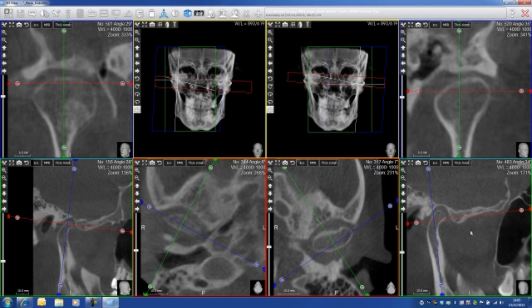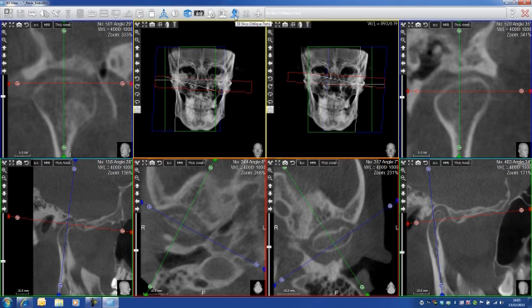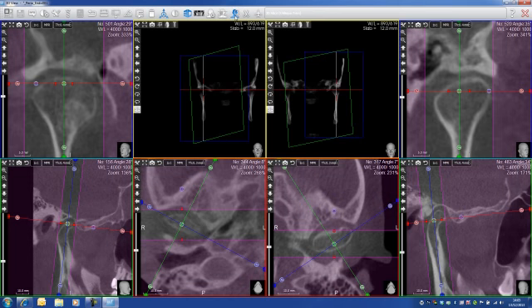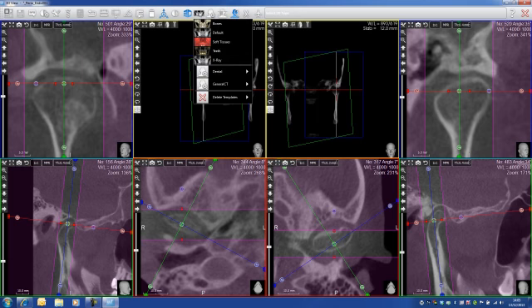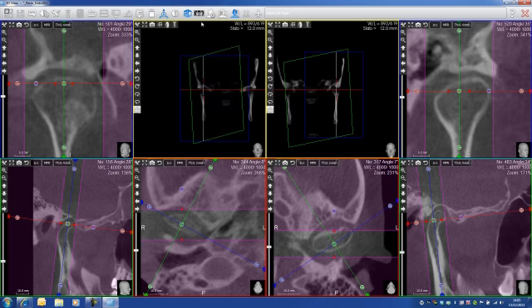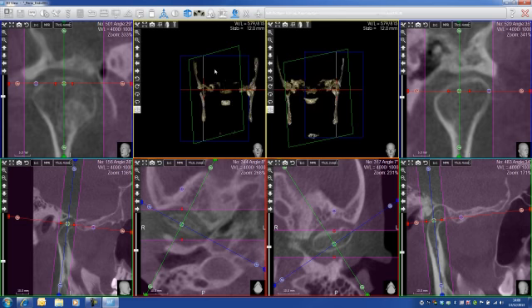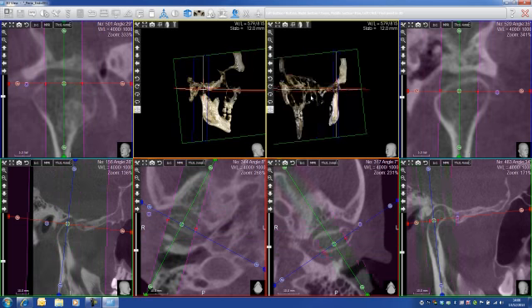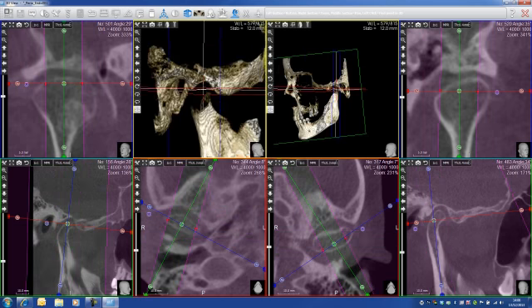So I have the 2D view of both condyles, left and right. Now I go on this function here which is called Trim 3D Slice. I click once, I go to filtering, I take bones. It takes a bit of time to analyze and load — and now I've got both my TMJs in 3D.